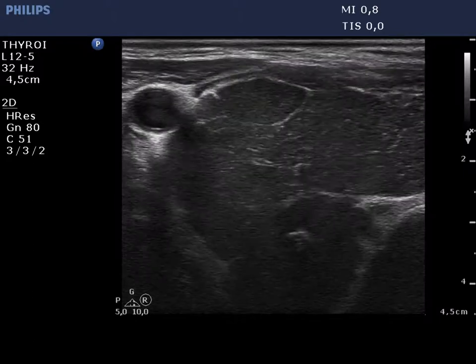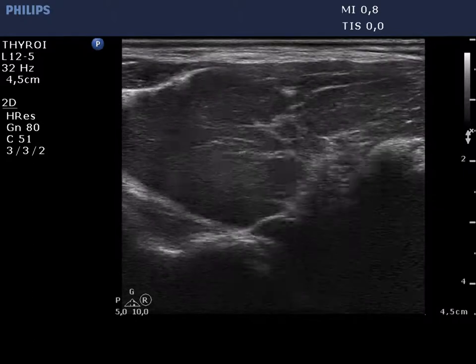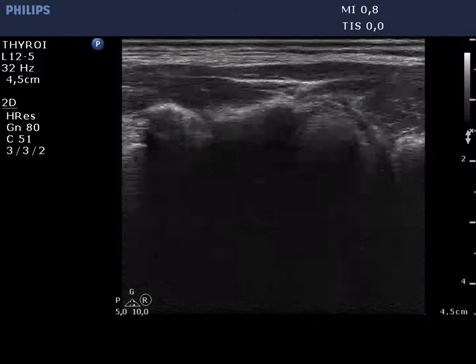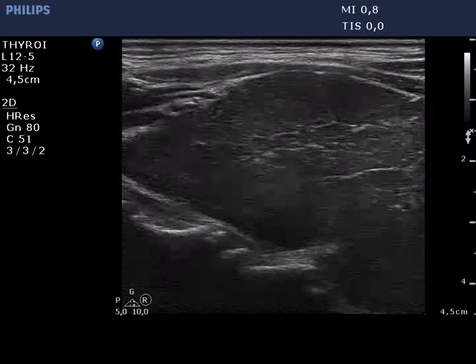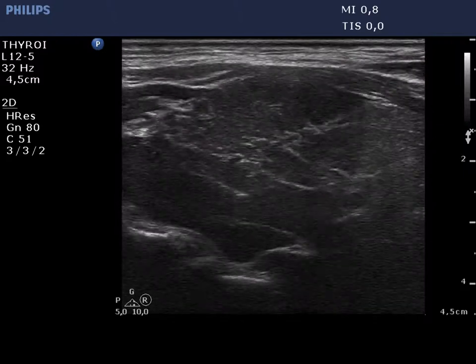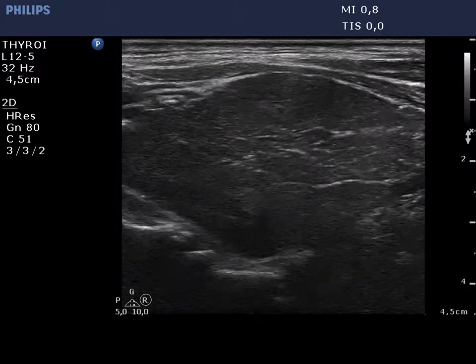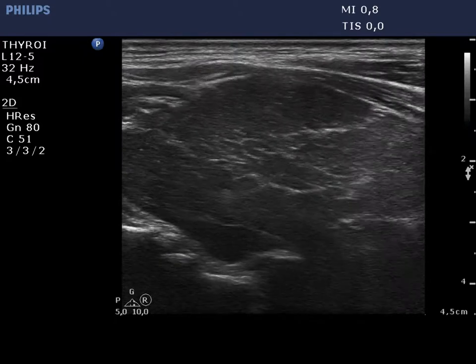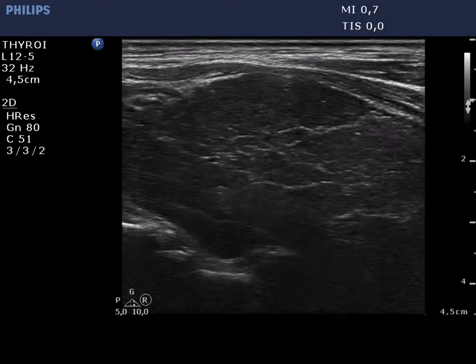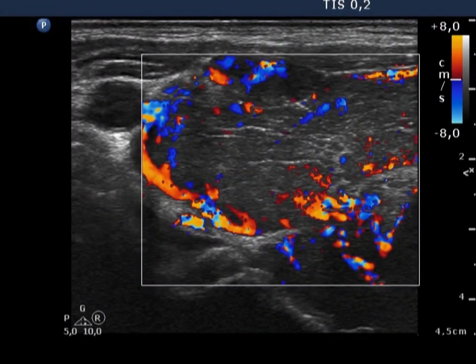We reset the depth in order to visualize the dorsal part of the thyroid, but neither the dorsal surface nor the lower pole can be seen. This means that the tumor spreads retrotracheal and substernal. An irregularly increased chaotic vascular pattern is demonstrated.